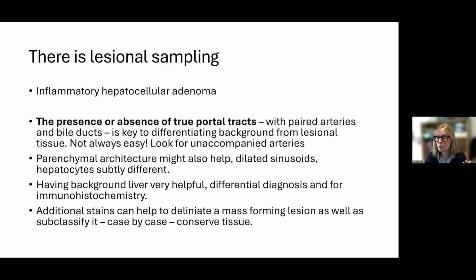I'm not saying it's always easy. I think this is a really difficult case that I just showed you, and I'm not surprised that the initial impression was that there wasn't a lesion present. It isn't always easy. And you will sometimes see some biliary structures, and whether or not you're looking at the duct itself or a ductule can be very difficult. So looking for those unaccompanied arteries, asking yourself the question, am I seeing portal tracts or not?